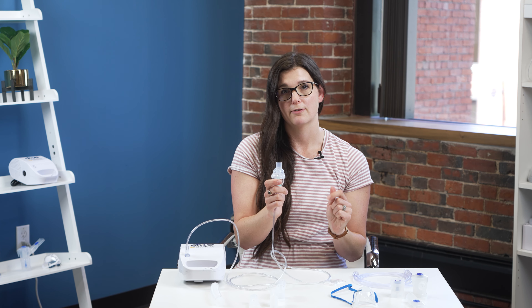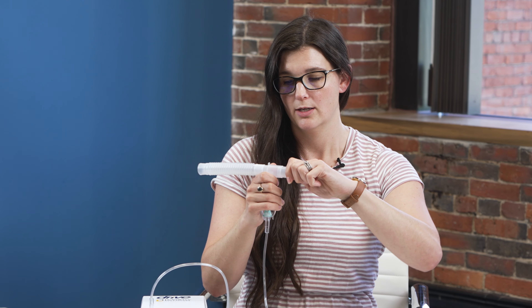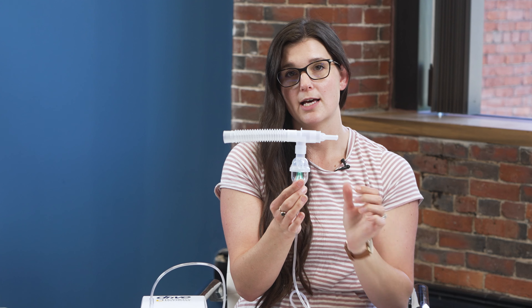Here's where it gets a little different for the mouthpiece on the disposable set. If you're using the mouthpiece, you have a T connector which has a larger opening and a smaller opening. The T connector sits on top, and you have a piece of tubing that goes on the back on the smaller section, and then the mouthpiece goes on the larger section. This one doesn't have a valve, so it doesn't matter which way faces up.